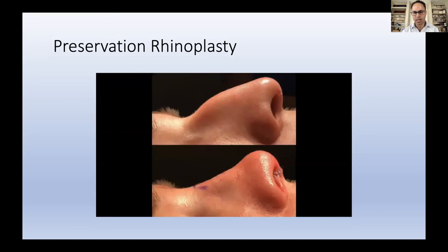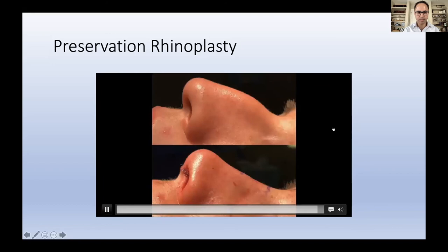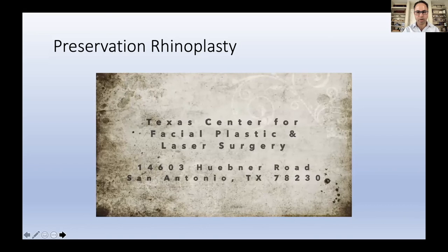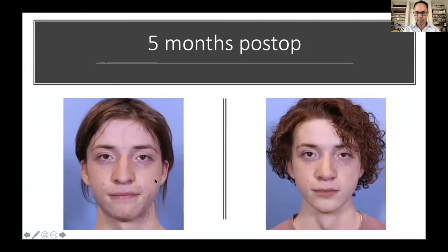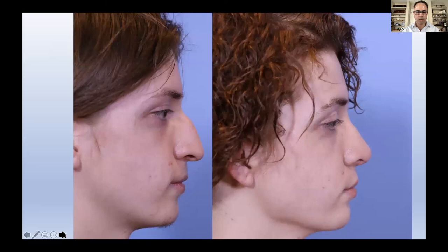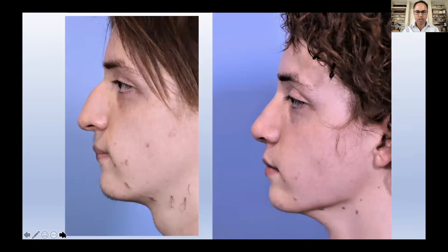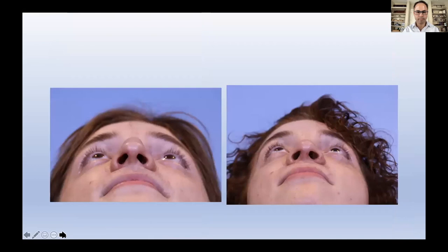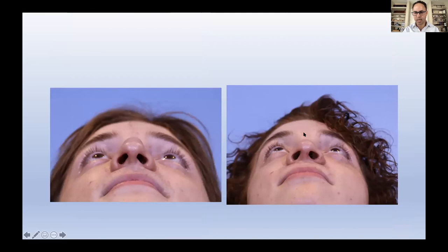At the end, this is our post-operative result immediately on the table. And here are his five-month results — before and after. We got a pretty good reduction of the dorsum. The trouble points for me were the short nasal bones, which I was very concerned about, but we were able to manage them utilizing this procedure. We did get a little rotation using a septal extension graft on the nasal tip. Here is the base view — you can see the extent of the large hump and how nicely it is reduced post-operatively. And that's our case.